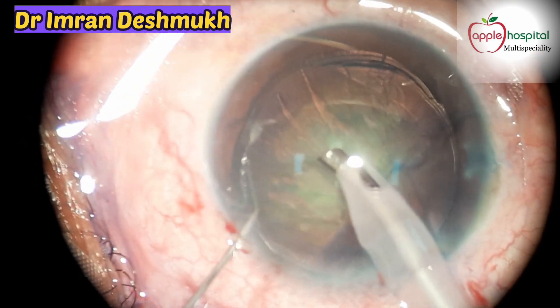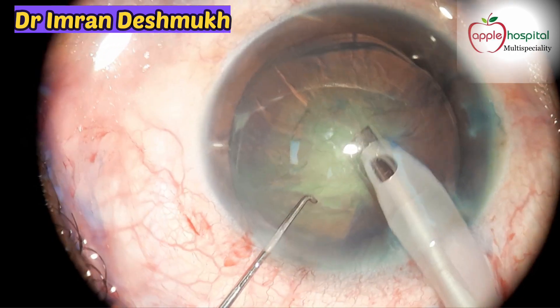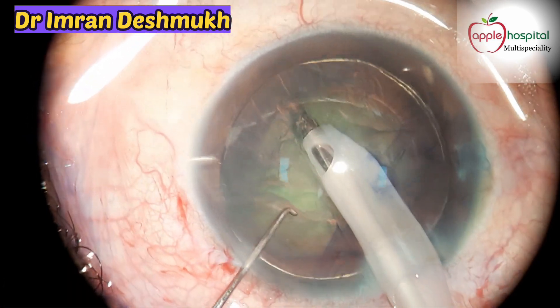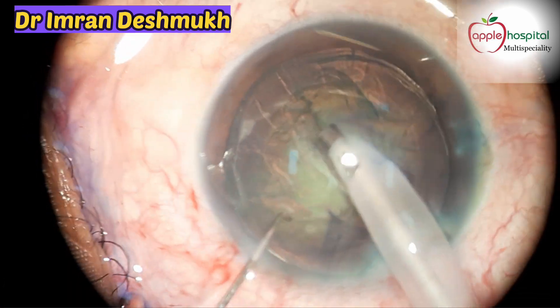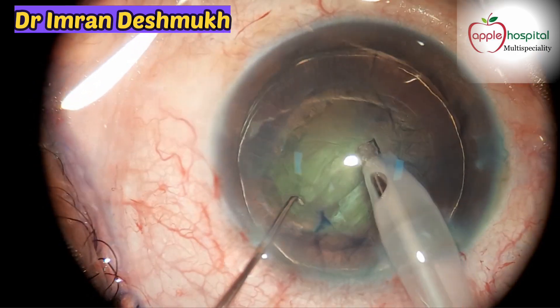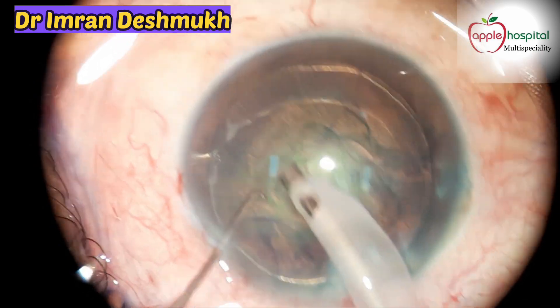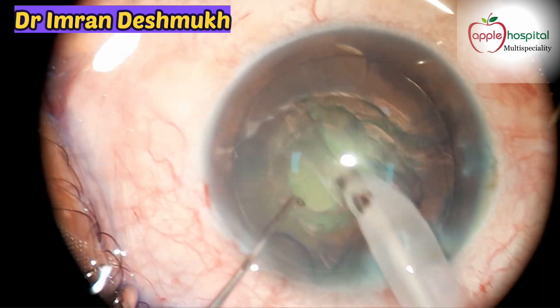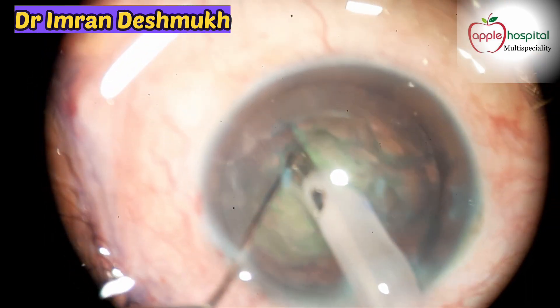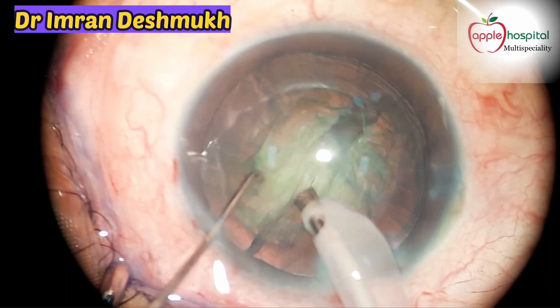We now insert the phaco probe to the main wound and the sinskey hook from the side port. Start trenching from the first half of the nucleus and don't be too deep. Now rotate the nucleus and trench the other half — see that the depth is adequate — and use the sinskey hook.